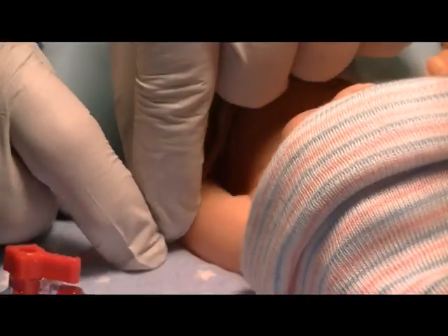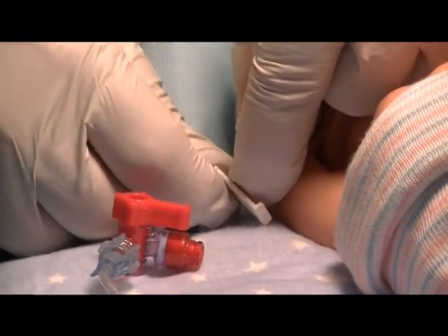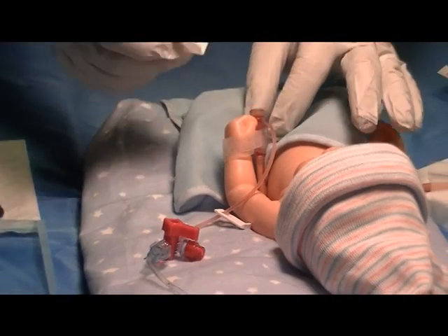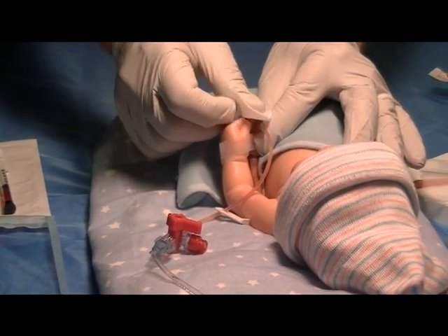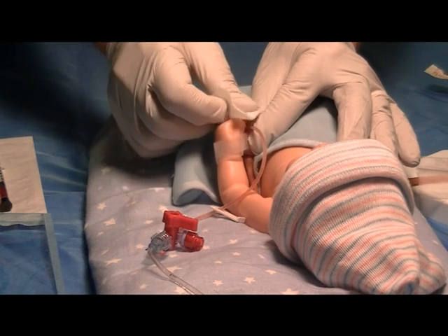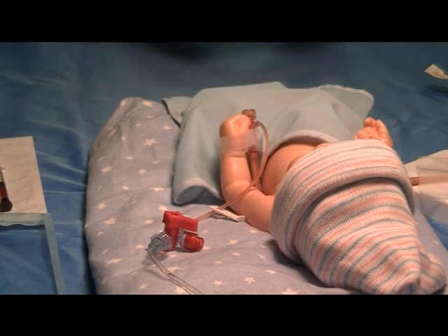Then you would go back to the line, unclamp the T to resume normal monitoring and again, reswab the T-connector to remove any residual that might be there.